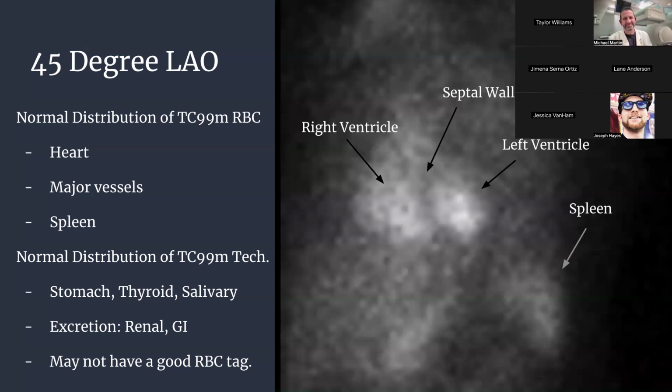So we have timers where we do all the tagging. We have a 5-minute one and then a 20-minute one. As soon as we put the blood in the vial, we start that 5-minute one. And what helps me with the other small syringes is doing this: it's 1, 2, tech, and then you start your 20-minute timer.